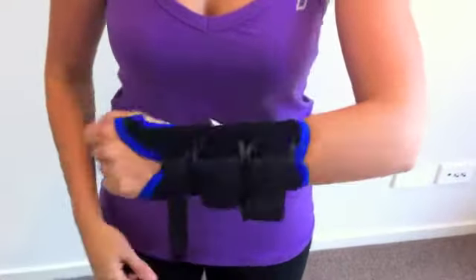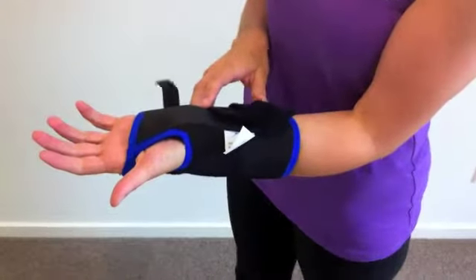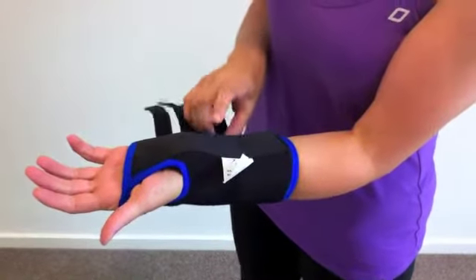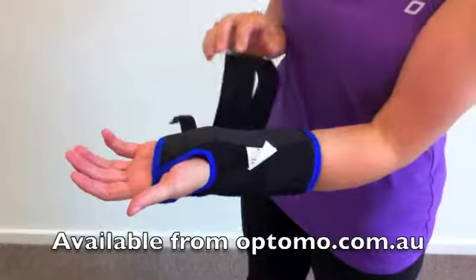As Gabby turns her hand over, you can see that the wrist brace fits comfortably over the thumb and provides good stability with a strip running down the middle of the brace. It's comfortable, durable, and in stock and ready to ship.